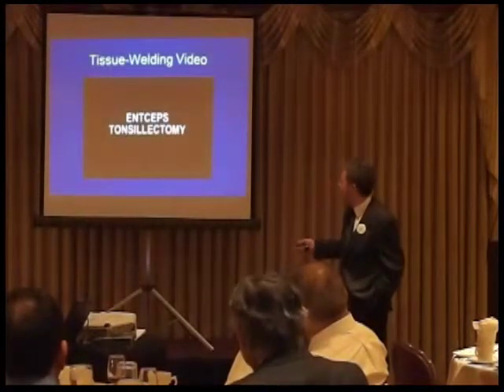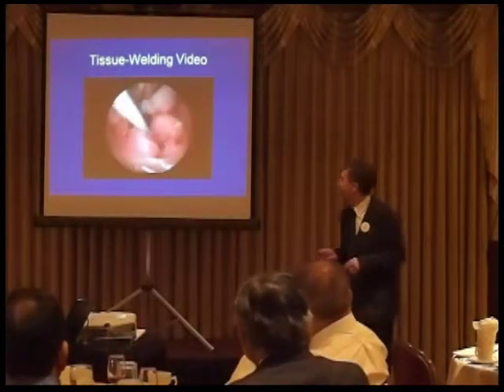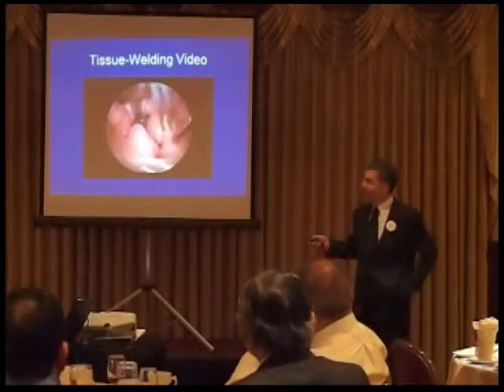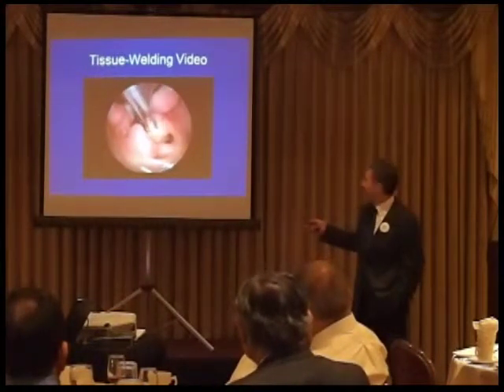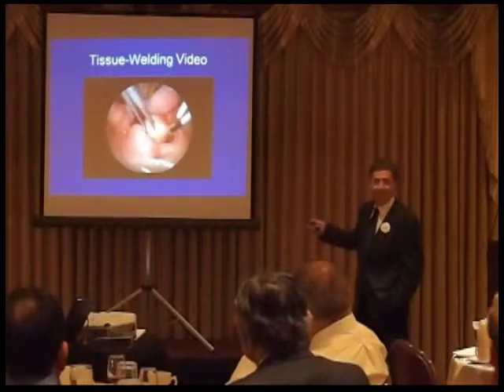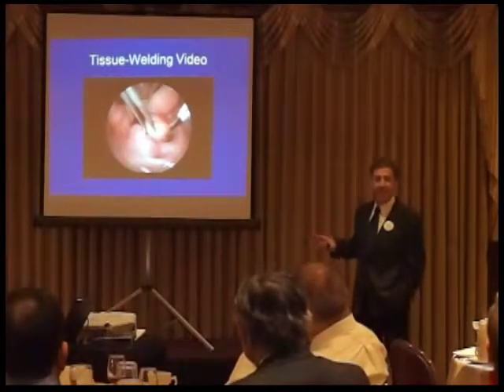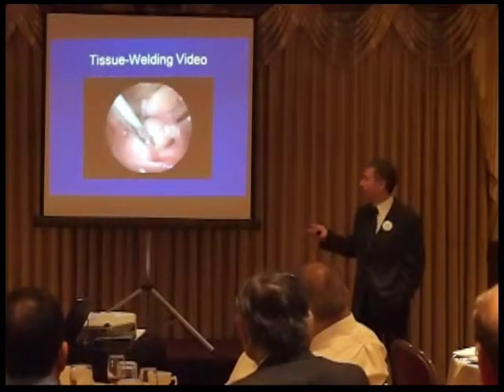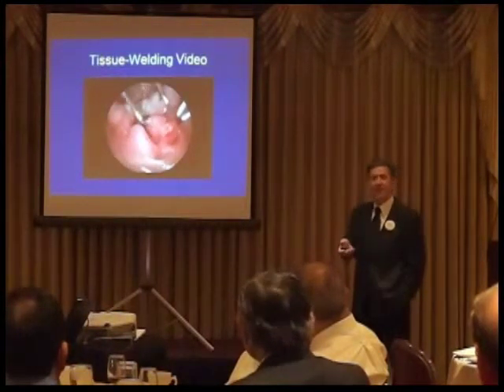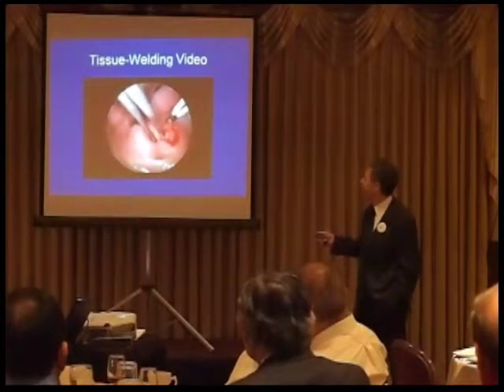And here's a video of it just to sort of show you. Good. I think it's happening. So this guy picked the world's easiest tonsillectomy to do this. I mean, Jim could take his clamp, just go across here and cut with his bovie and say, okay, I'm done. It's been 2 seconds. But this guy, he's no idiot. He used a very, very simple tonsillectomy. But here you see the heating element. The sound isn't coming through. Yeah, it probably turned itself off.